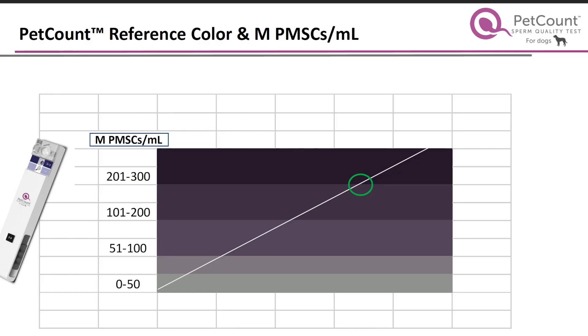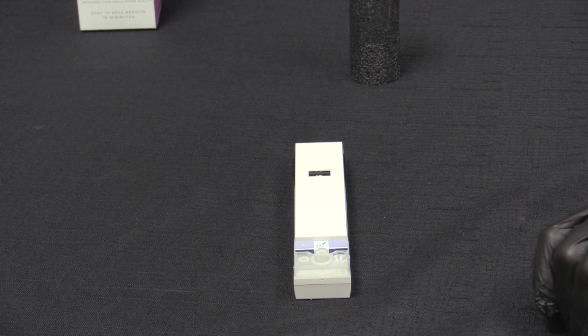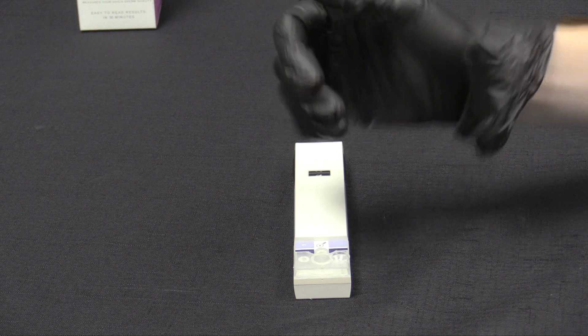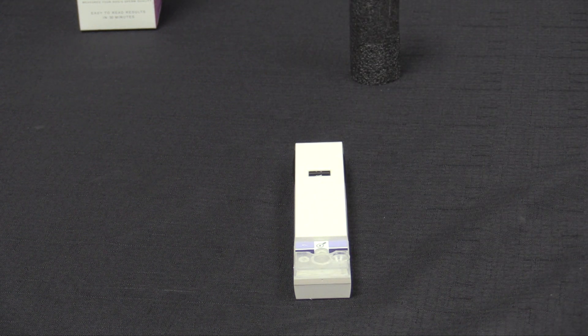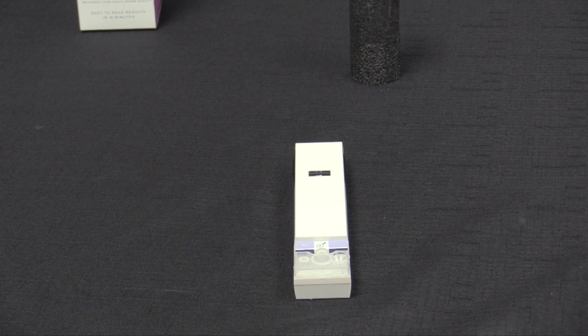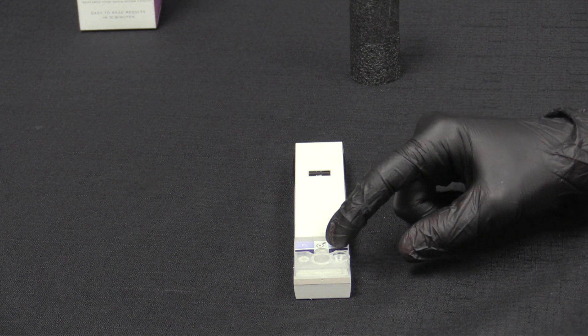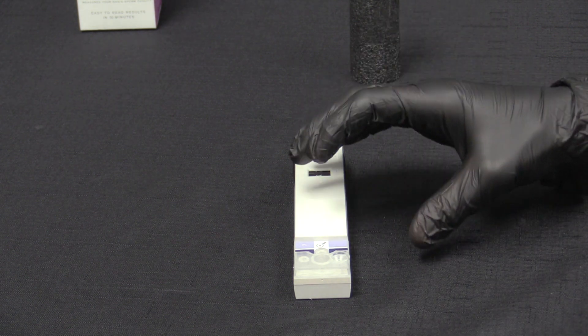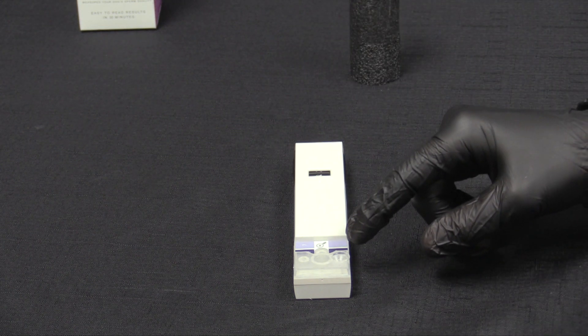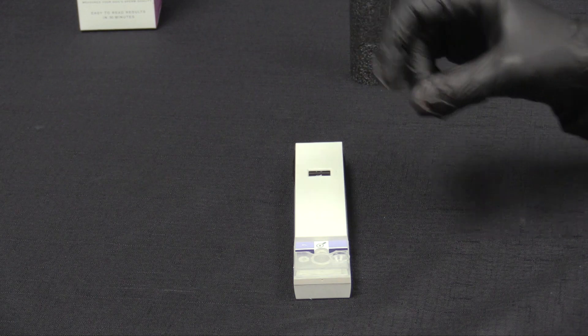Remember that the darker the purple the more PMSCs are in the sample and the lighter the purple the less amount there will be. Be careful ensure that you've slid the bar back within about 30 minutes after having deposited the semen into the sample well to maintain test validity. Also be sure to interpret the test color result within five minutes after having pulled the slider back. The valid result will be within five minutes of pulling that slider back.